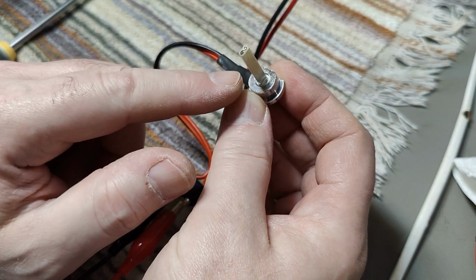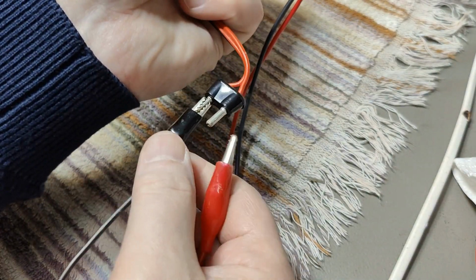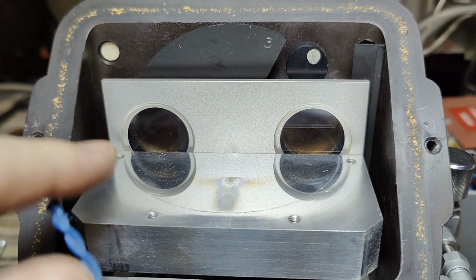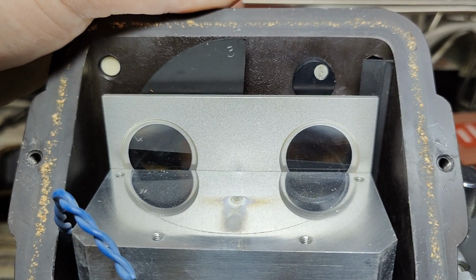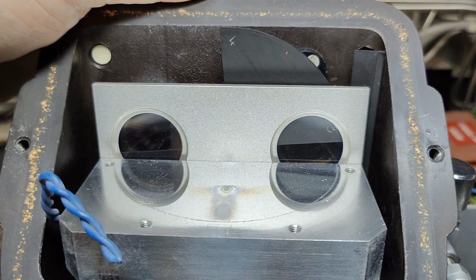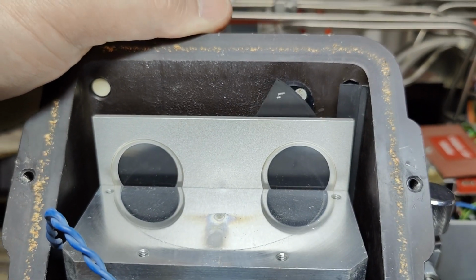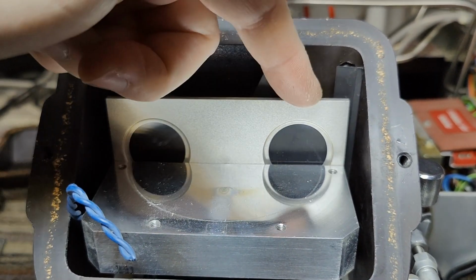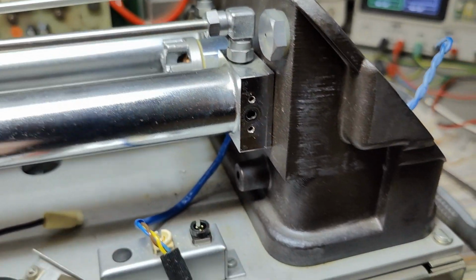So this is of course a heater, so this is going to go red glowing hot. I am getting a little bit confused about this concept here, because look at that. When I turn this sampler around here, see, it opens both of them at the same time, and it closes both of them at the same time. Maybe there's a little bit of a time delay. I don't know. But that is a little bit confusing. I would have the idea it would be turning on and off like that, but that is not how it works.